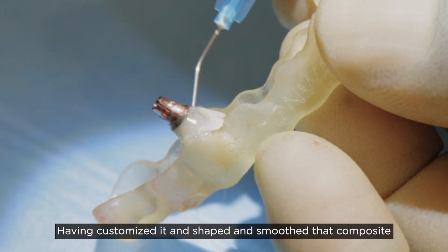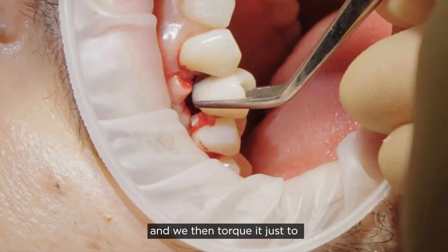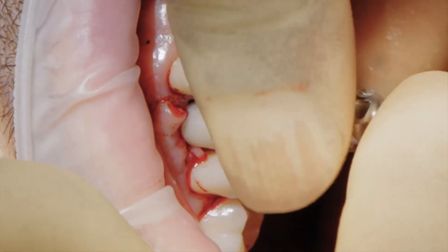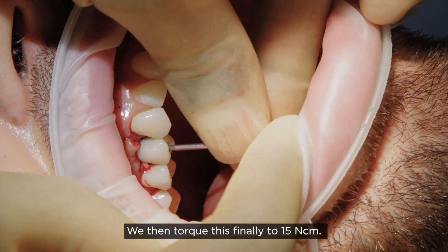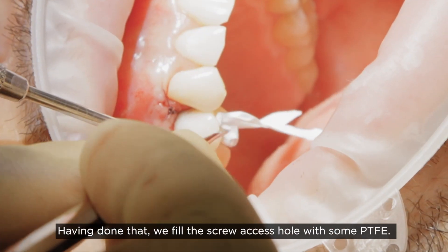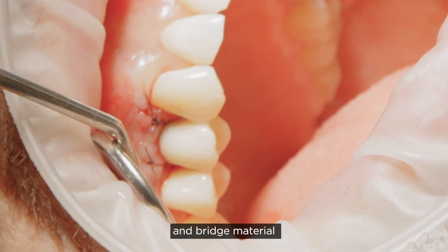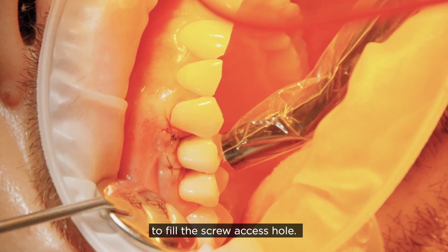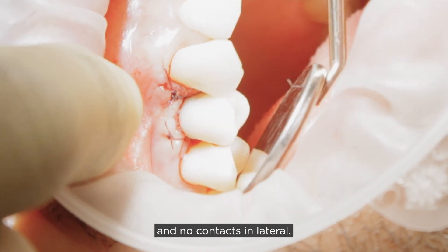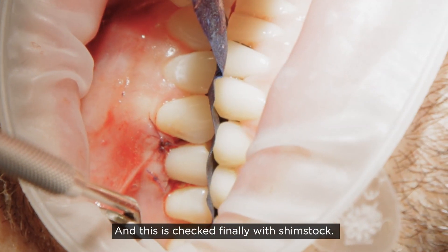Having customized, shaped, and smoothed the composite, we put this back into the mouth. We then torque it just to fit by hand to around 10 Newton centimeters, then finally torque to 15 Newton centimeters. Having done that, we fill the screw access hole with some PTFE, then use a temporary crown and bridge material to fill the screw access hole. We check the occlusion to ensure no contacts in centric and no contacts in lateral, checked finally with shim stock.